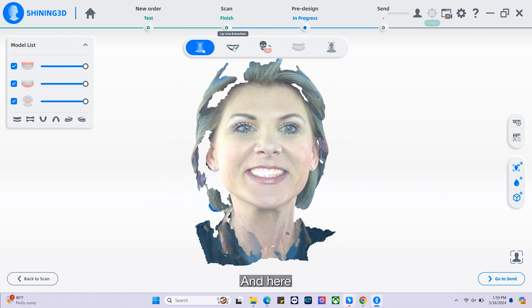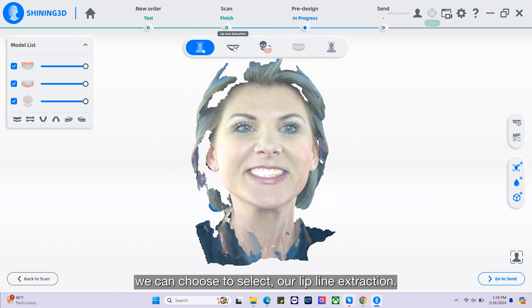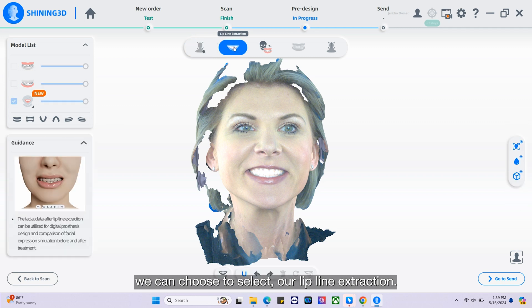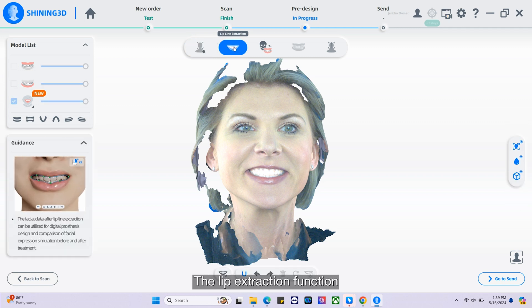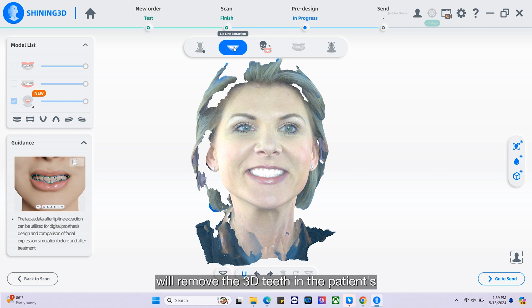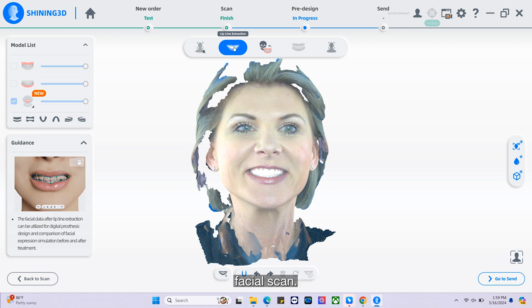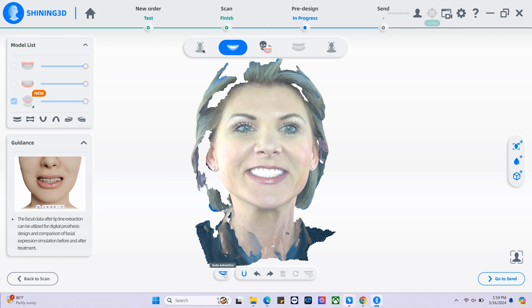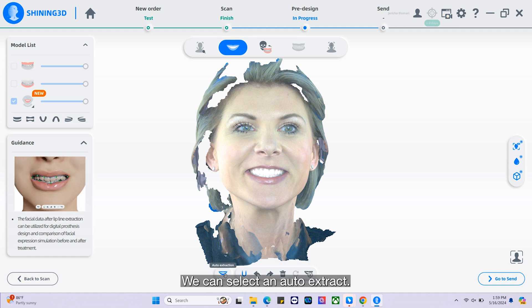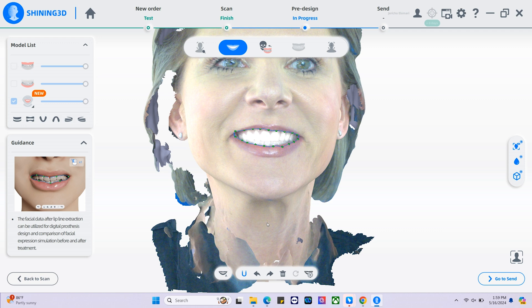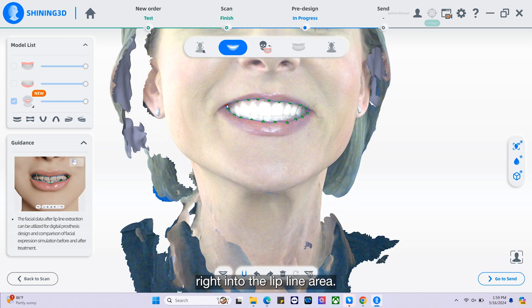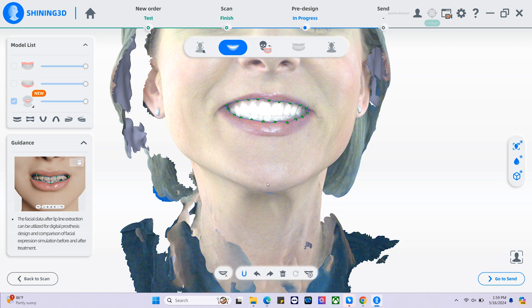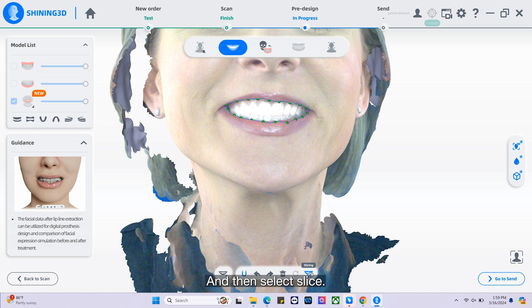Here we can choose to select our lip line extraction. The lip extraction function will remove the 3D teeth in the patient's facial scan. We can select auto extract, and then we can move the green dots right into the lip line area and select slice.